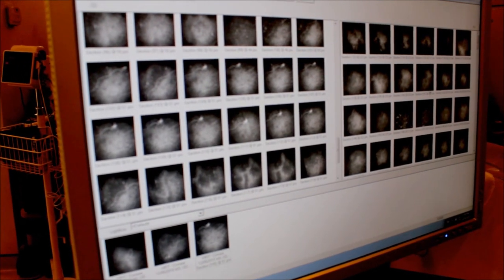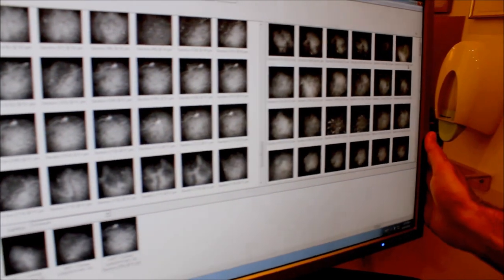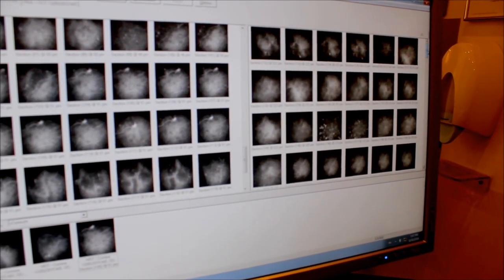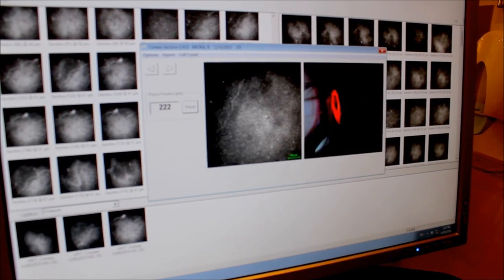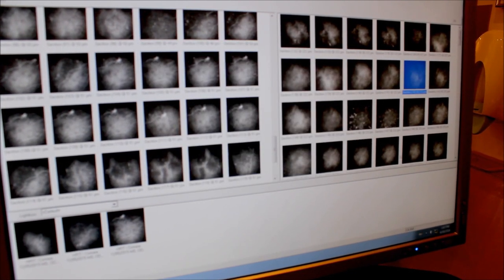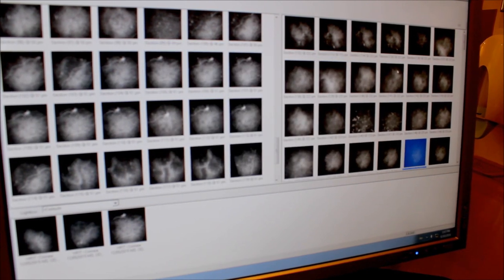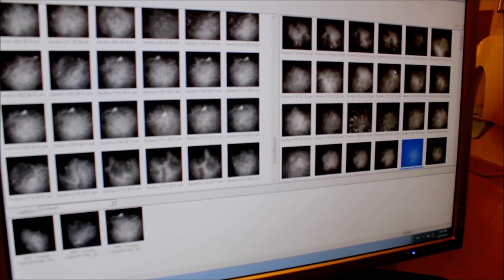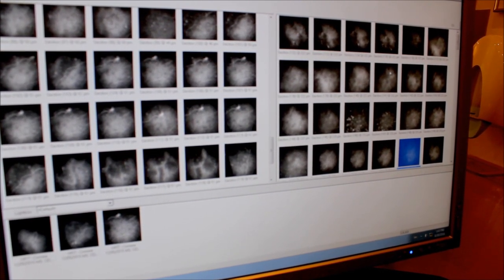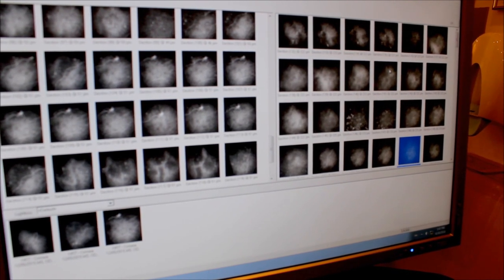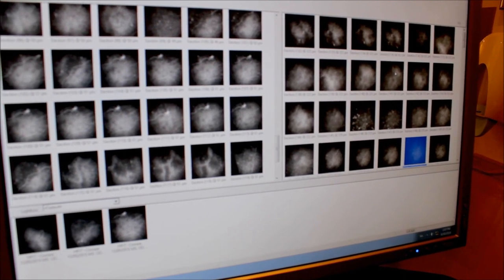So then what we do, we repeat the procedure for the other eye. A quick browse through the images. We see, for example, here that there is an image with one only nerve, but then there is an image with perhaps two nerves. This is because we're moving the microscope very slightly across the x-axis to capture as many nerves as possible. By doing that, we see different densities in different parts of the cornea.